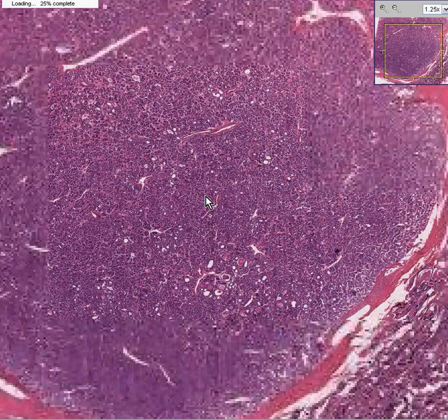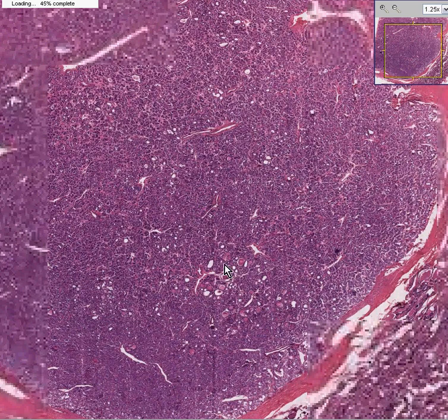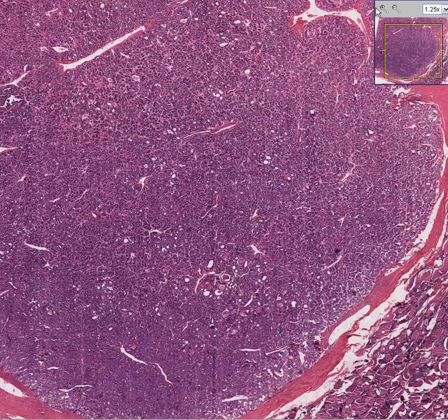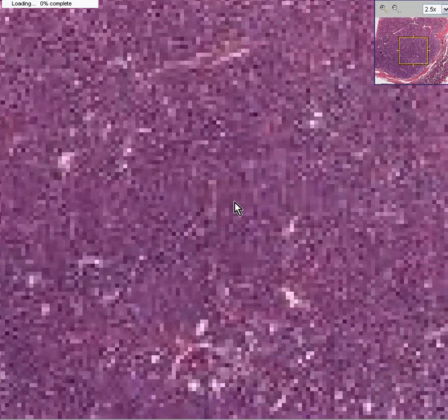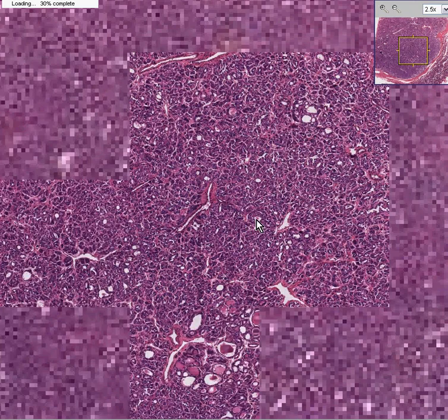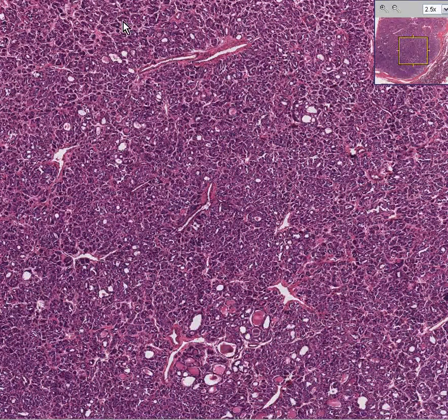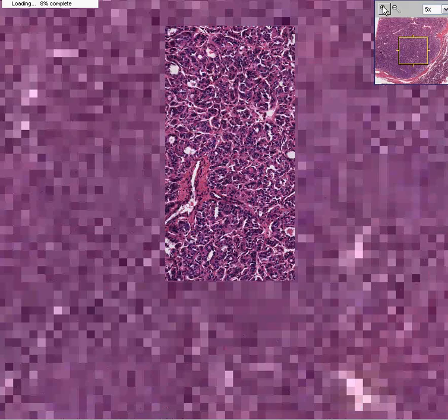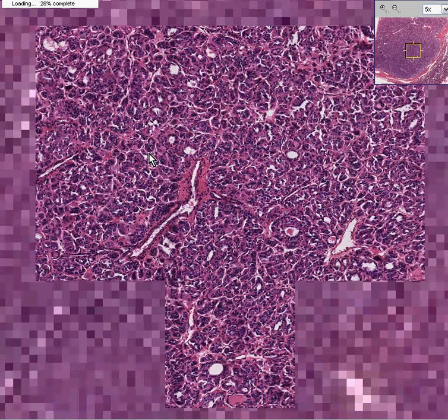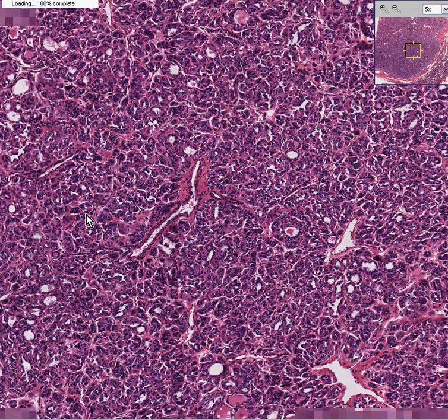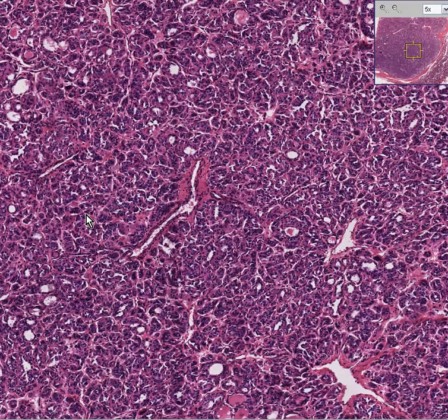Notice that in some areas you can see small follicles — like here, like here, like here — and there's even a little bit of colloid in them. But notice for the most part the follicles are extremely small. That's why this is called a micro follicular pattern of growth. So this is a micro follicular adenoma.